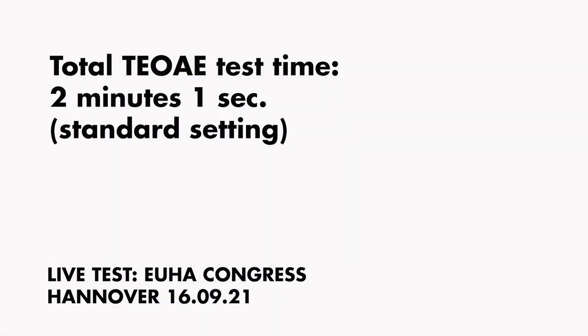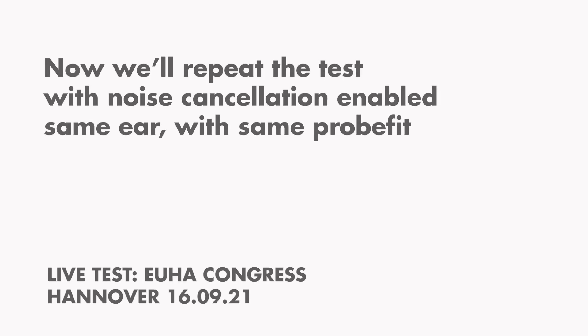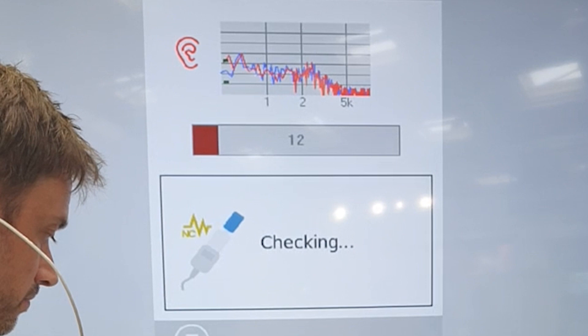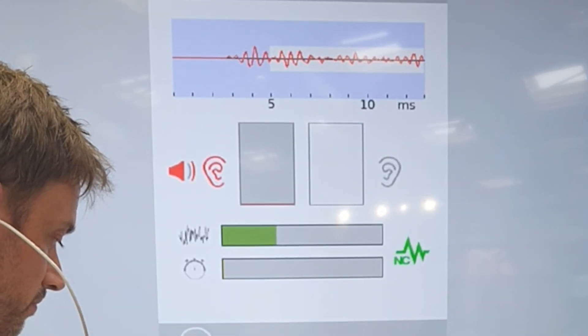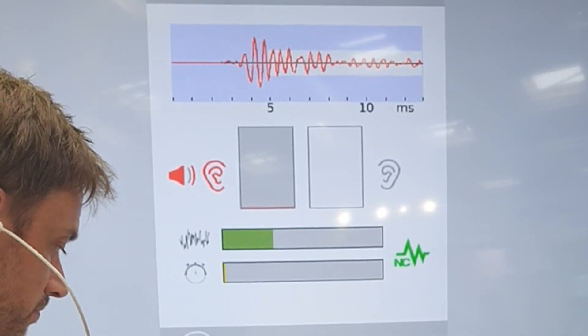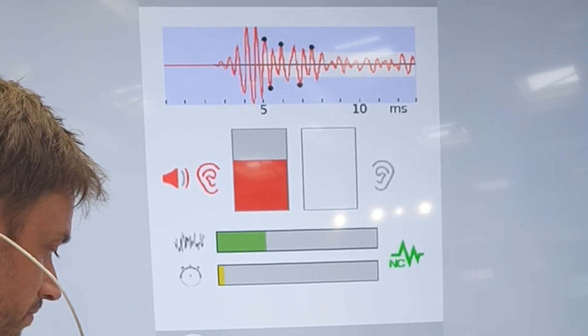Now Thomas is going to set the noise cancelling up and repeat the test on the same side with the same probe fit, so we're keeping that all maintained. The test has started — you'll see the noise cancellation sign on the right hand side, just below the noise bulb.